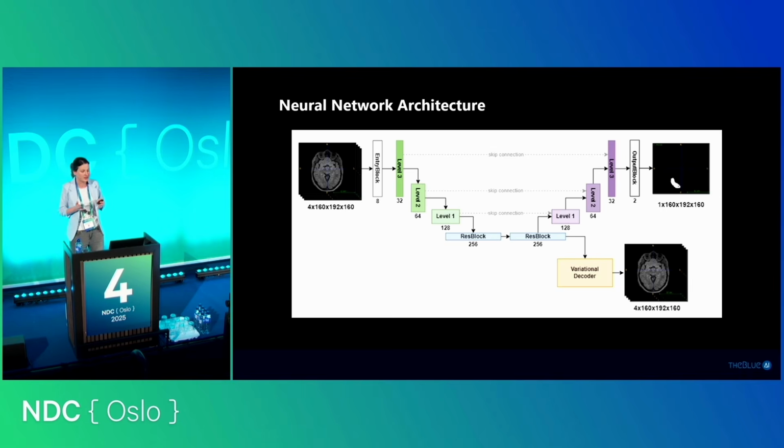It's quite abstract. So that from this bottleneck, in the second part of the U, we are trying to get this information back, either via creating the same image or via just getting some parts that are especially important to us, like in this case, quite a huge FCD. And it turns out that by this process, the model is really able to get the super important features for our goal, which are the FCDs in here.